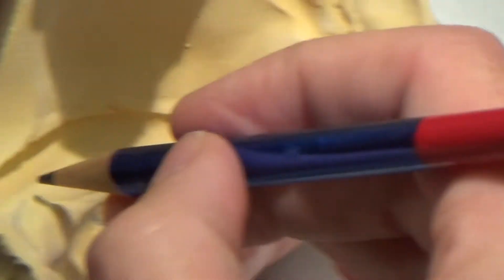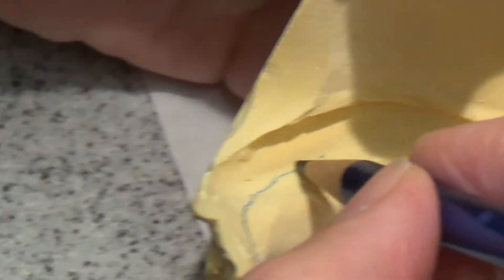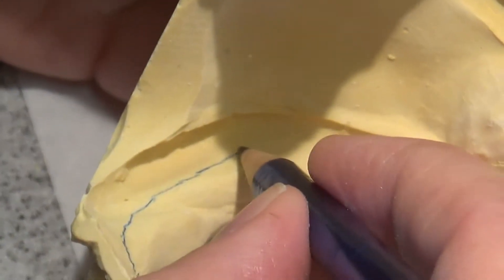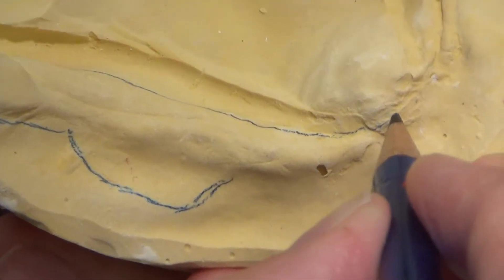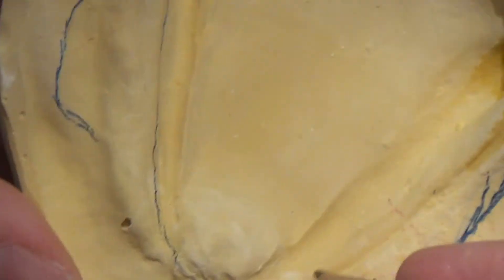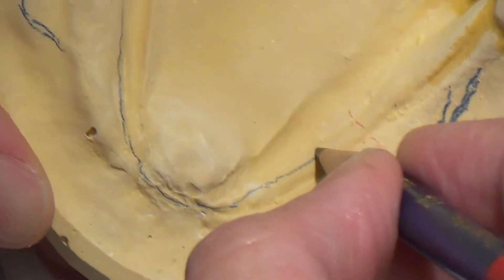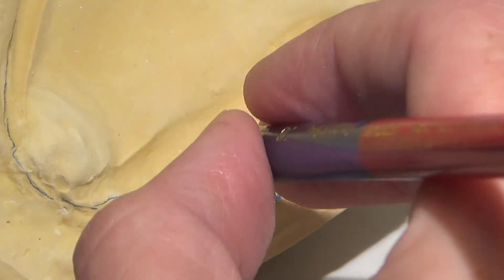So I'm going to come short here. She's got some undercuts I'm going to need to flow a little bit of wax into. Again, modifying my tray up in this area because I can't really come up around frenna that don't exist. Her ridge is so severely resorbed, we just don't have it.